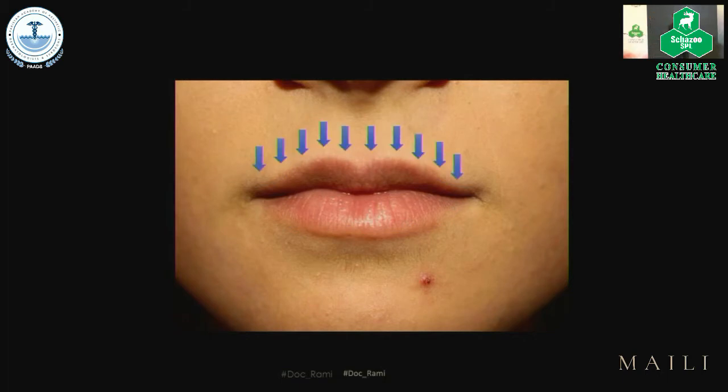But then something came up they call the Russian lips. The Russian lips basically is going very, very superficial, with multiple injections along the lip in order to give it that nice plumpy look. So it's very subjective. You guys decide what you want to do.